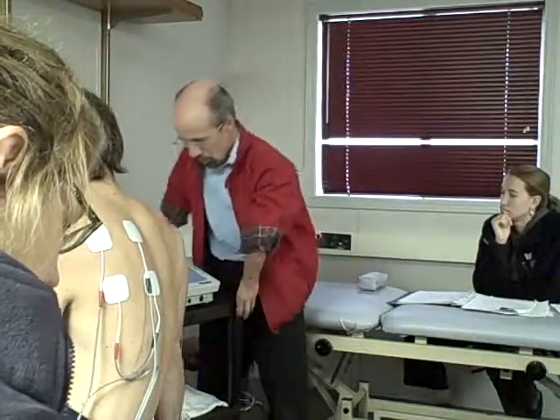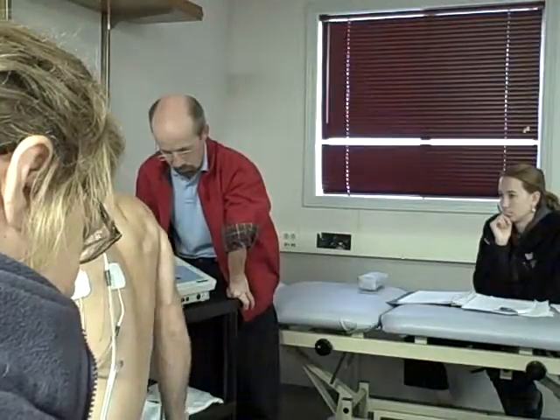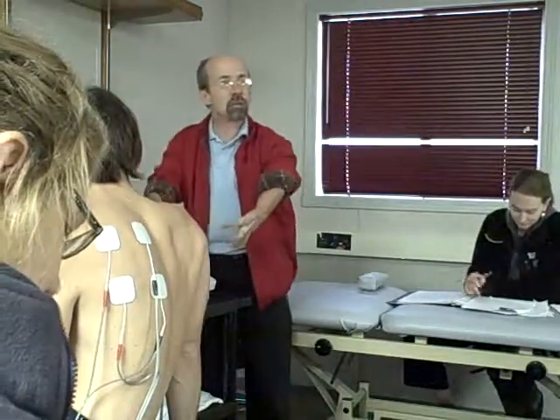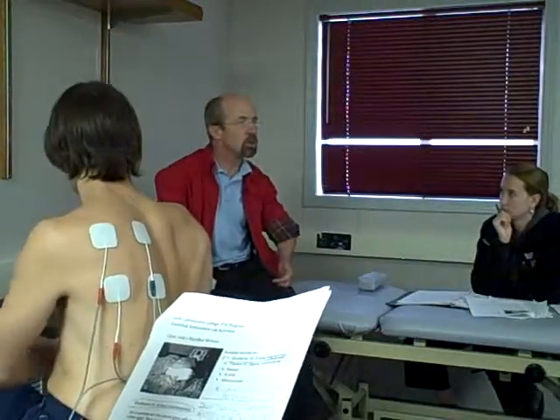Okay, so why is channel 2 linked and channel 1 not? I don't know, it just does that. And again, I don't want to get too fixated on this particular box because you might get out in the field and there are lots of different machines. So let's try to stick with the principles right now.